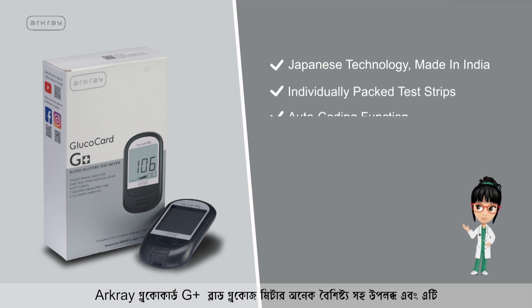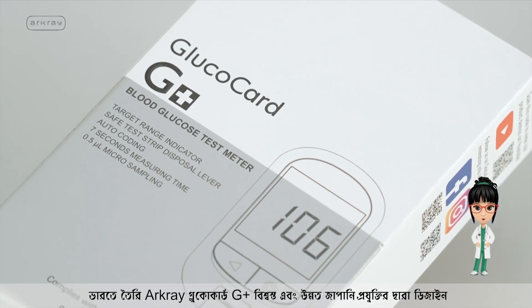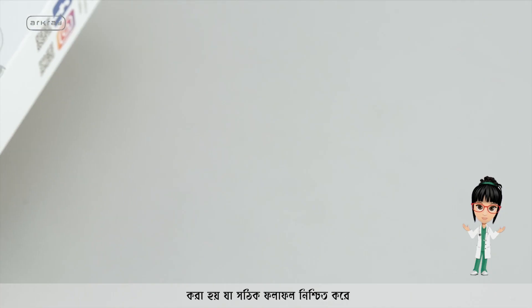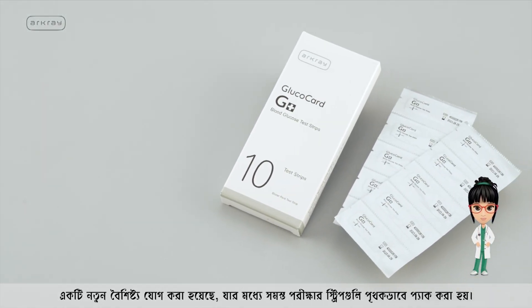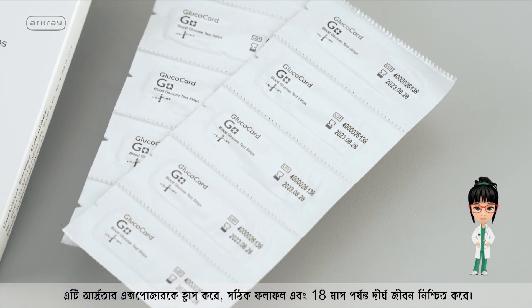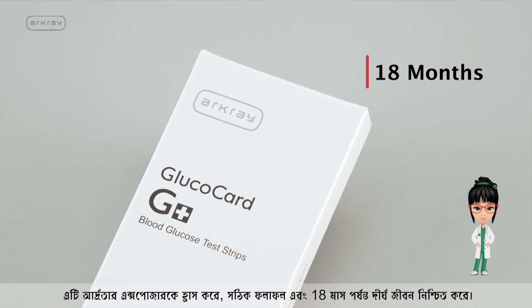The R-Cray Glucocard G Plus Blood Glucose Meter comes with many features that make diabetes management easy. Made in India and designed with trusted and advanced Japanese technology, it ensures accurate results. A brand new feature introduces individually packed test strips, minimizing exposure to humidity and ensuring accurate results with a longer shelf life of up to 18 months.